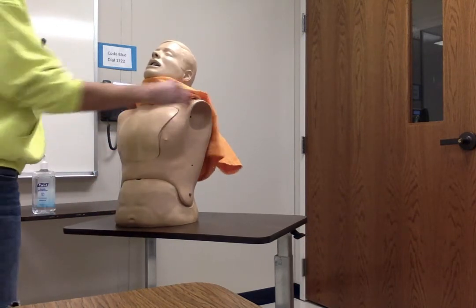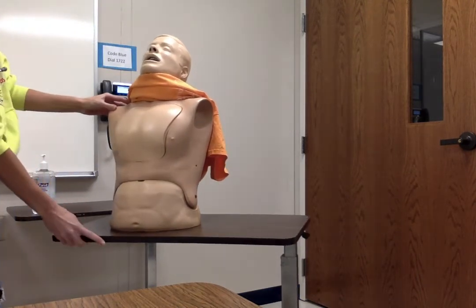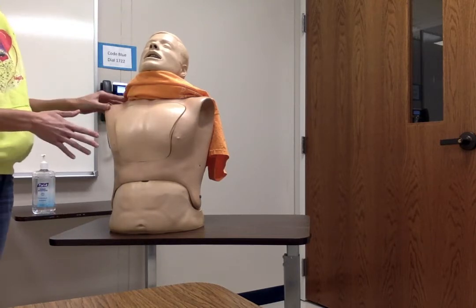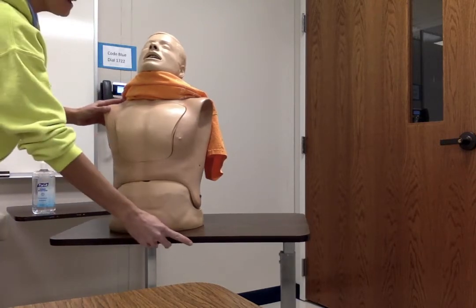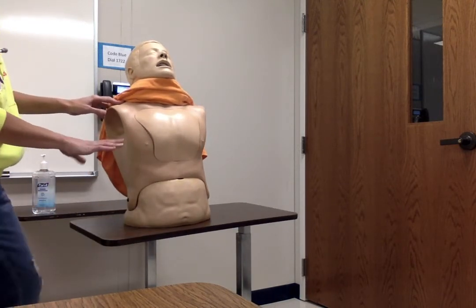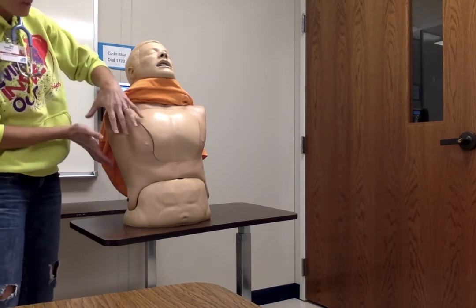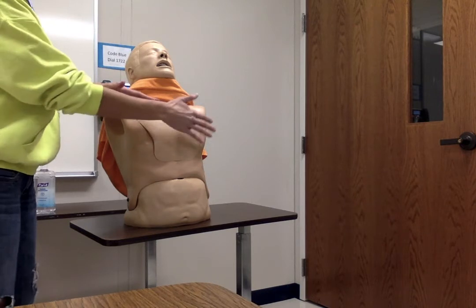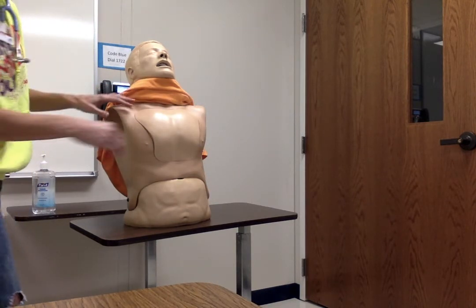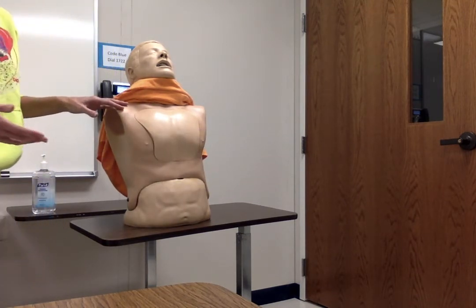Another thing I want to note is that when you are listening, you would also listen on the side. The left lung has two lobes, the right lung has three lobes. So you're going to be listening to the patient's sounds on the sides as well. You'd have the patient lift their arm over, and then you're going to listen on the right side to four places, but on the left side you only need to do three because of the lobe differences.